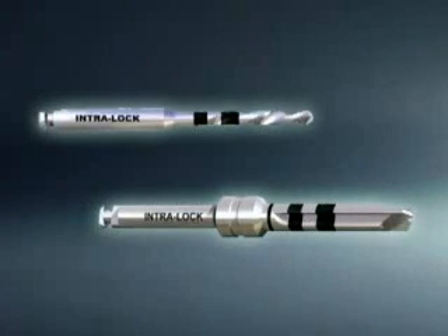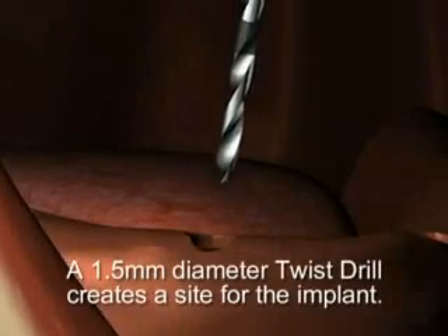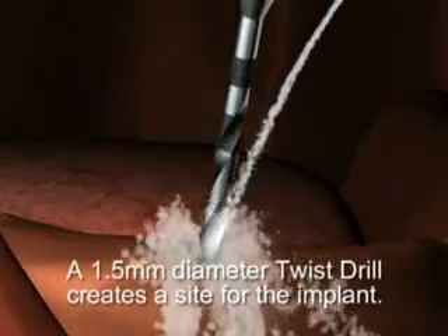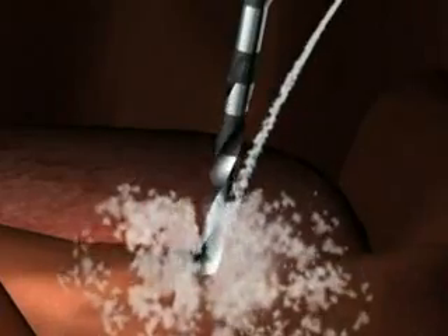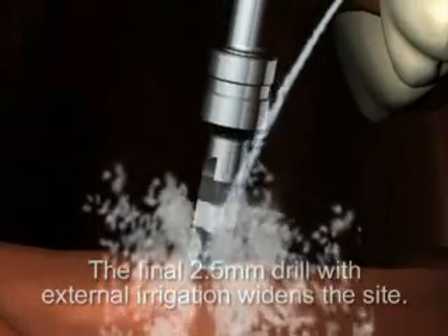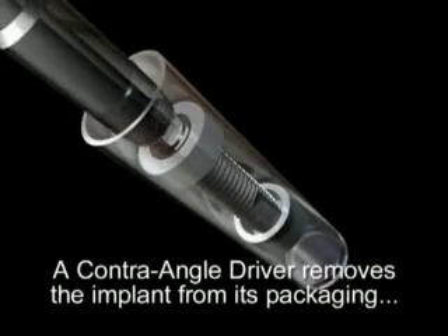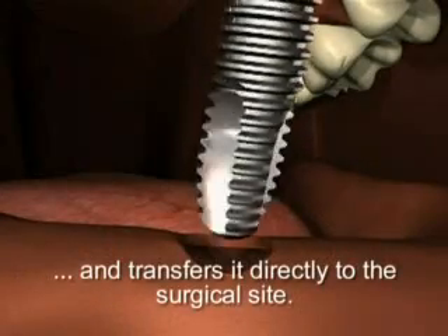A constant external flow of sterile irrigation should be applied during the drilling stages. Laser-etched depth marks on the drill correspond to the length of the selected Milo implant. Use a 1.5 millimeter diameter twist drill at 1000 to 2000 RPM to create an initial implant site, using an up and down pumping action. Light repeated intermediate vertical introduction of the final 2.5 millimeter diameter drill at 500 to 1000 RPM widens the site. A contra angle driver attached to a slow speed handpiece slips over the o-ball to remove the implant from its sterile packaging and transfers it directly to the surgical site.